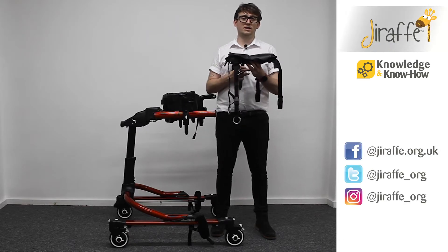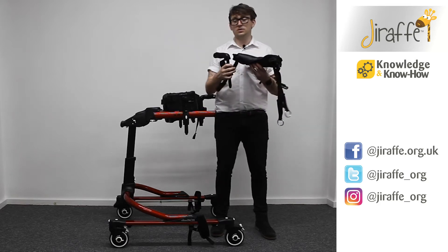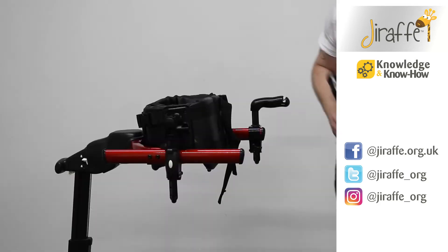We're now going to take a look at fitting the hip positioner onto the dynamic pacer. The first thing that we need to do is fit the handholds.